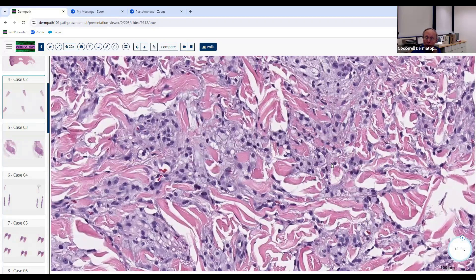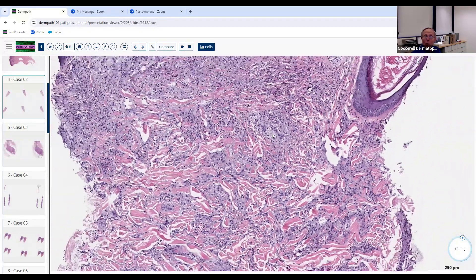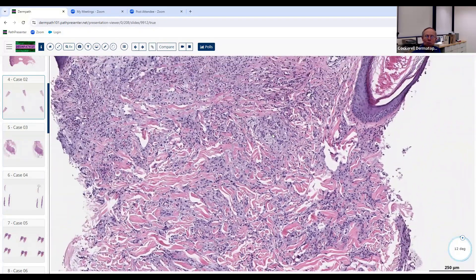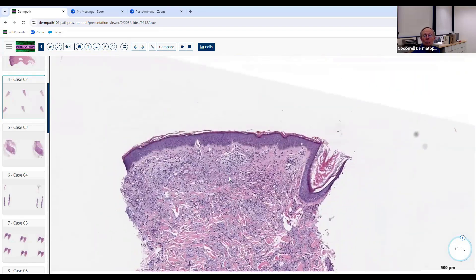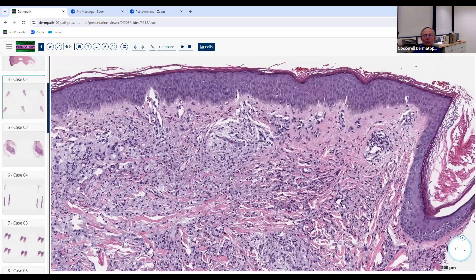Another entity that can sometimes look like this is scleromyxedema or lichen myxedematosus. That also gives you histiocytes scattered between collagen bundles. You don't get foamy histiocytes, but you get histiocytes and fibroblasts arranged in a north-south-east-west distribution — the so-called busy dermis type of differential diagnosis. There you also get mucin between the individual collagen bundles, but you do not get mucin inside the cells in that entity.